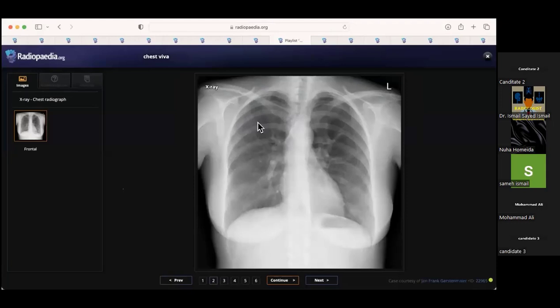Yes. Okay. So this is a young patient who presented with, let me just give you the correct history.